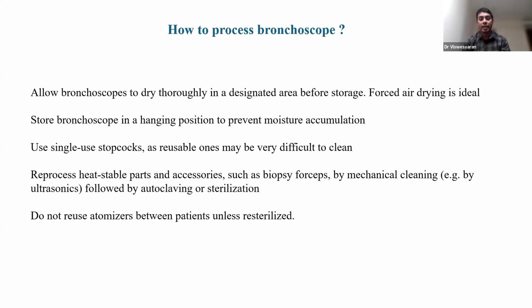Store the bronchoscope in a hanging position to prevent moisture accumulation. And use single-use stopcocks, as reusable ones may be very difficult to clean. And reprocess heat-stable parts and accessories such as the biopsy forceps by mechanical cleaning followed by autoclaving or sterilization, and do not reuse atomizers between patients unless re-sterilized.